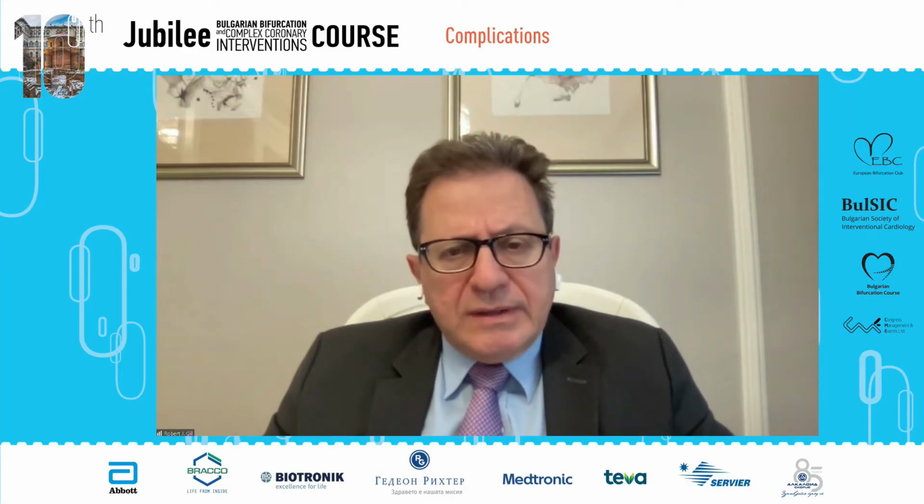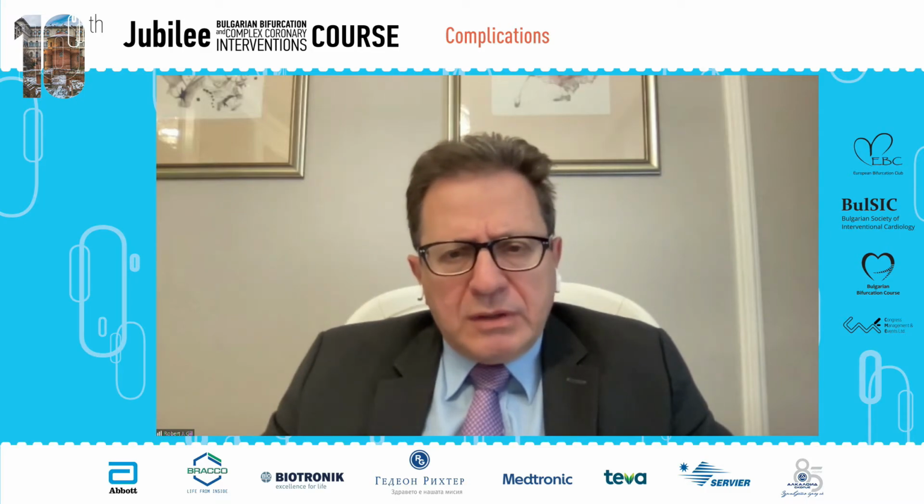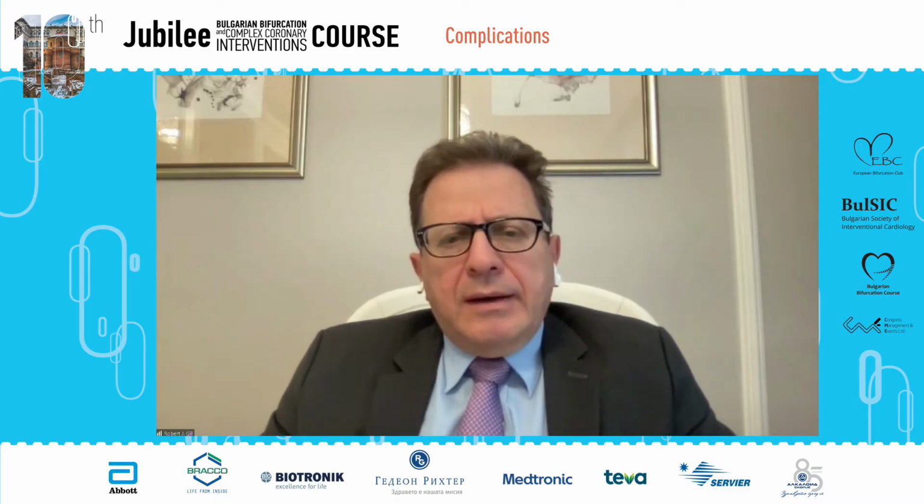They have a new version of the program, and they are very experienced with the usage of this device, 2-3 operations per week. So maybe this is also not so aggressive. It is really a minimally invasive approach. Okay. They are able to, let's say, use the right internal mammary artery as well.